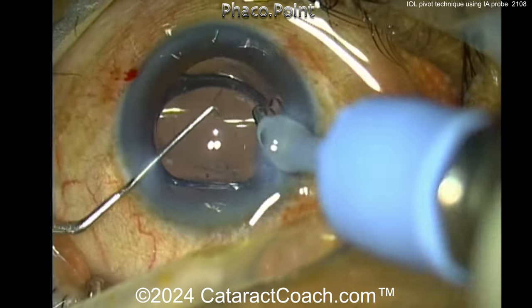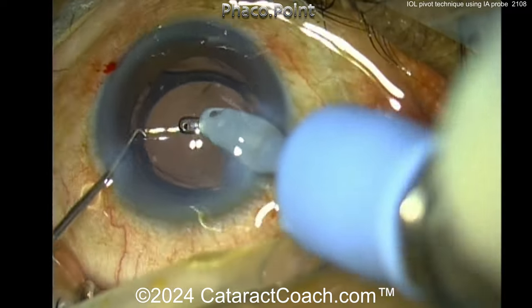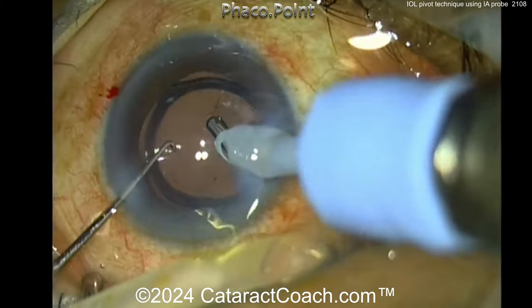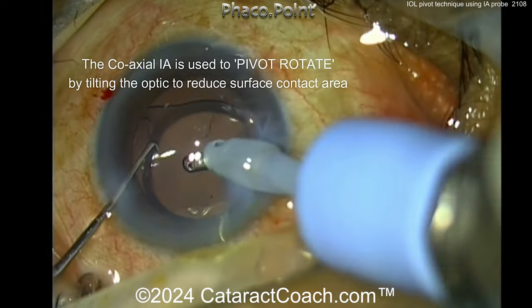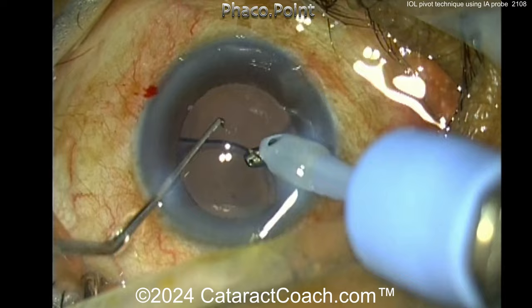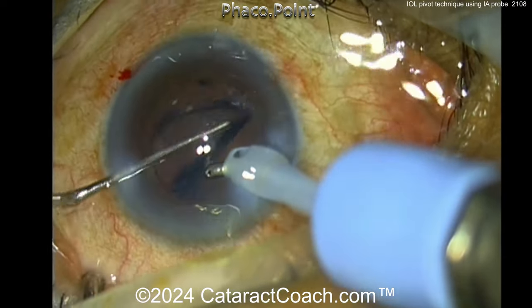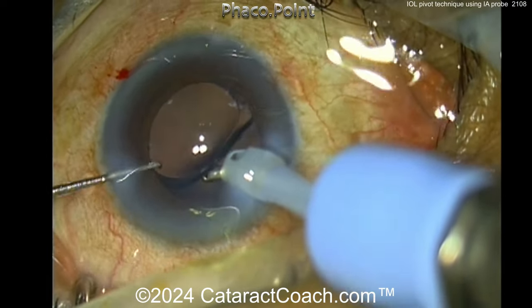Our surgeon says you can rotate in any manner if you use this pivot technique. While removing viscoelastic, you go under the optic with the tip of the coaxial IA probe, getting a pivot point. Once you're lifting it up, you can pivot and rotate the lens in any direction — clockwise or counterclockwise — and you can see it rotates very, very easily.